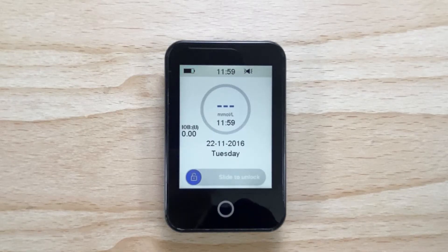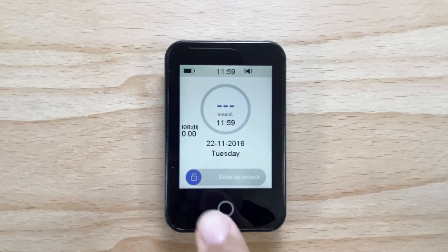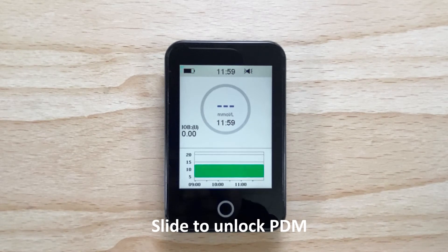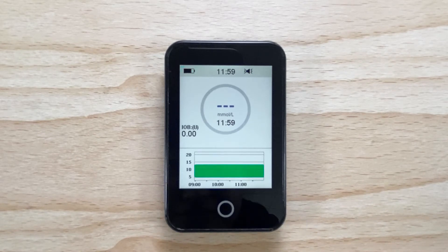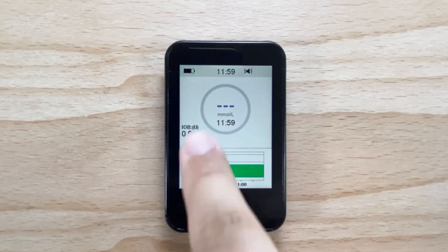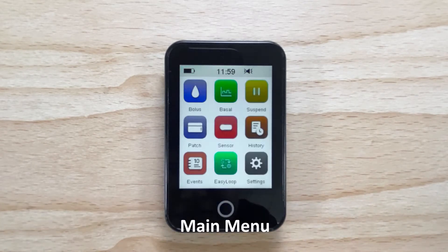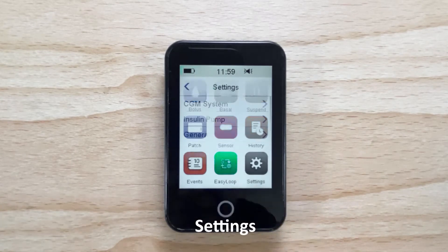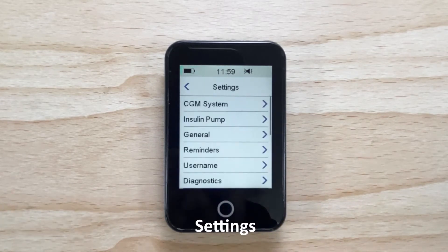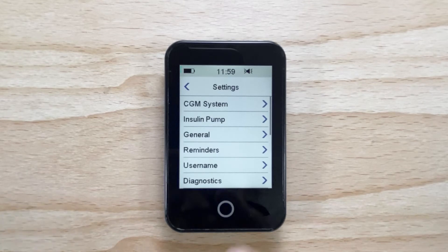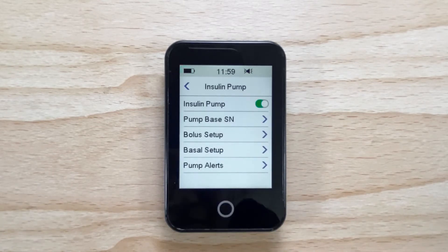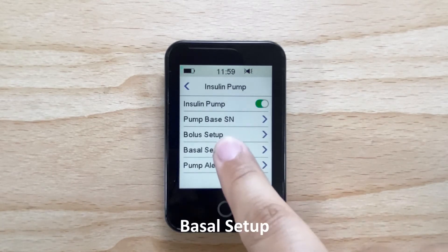To set up your basal rate on your PDM, slide to unlock your PDM. Slide your finger from right to left to access the main menu. Tap on settings. Tap on insulin pump. Tap on basal setup.